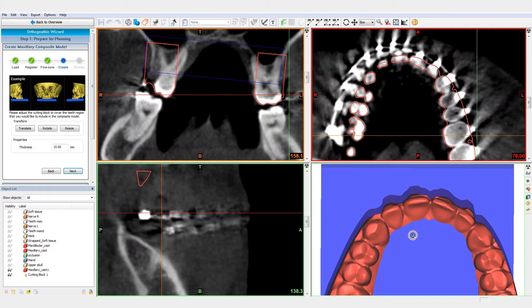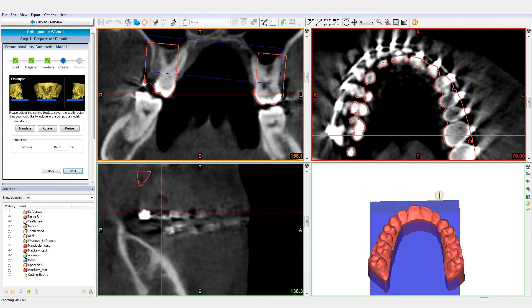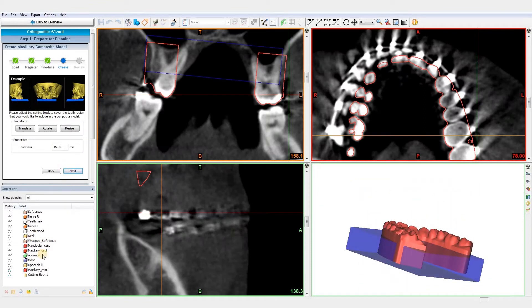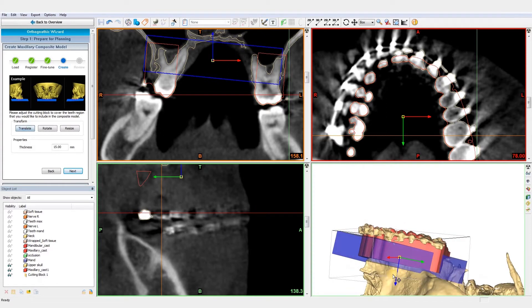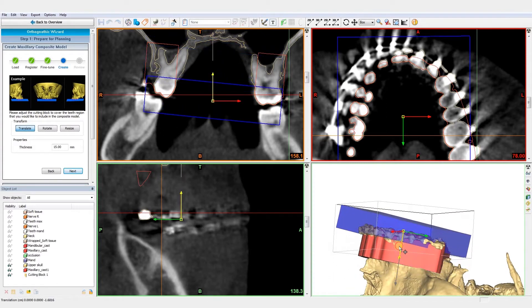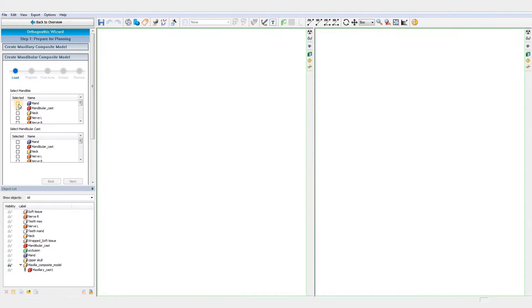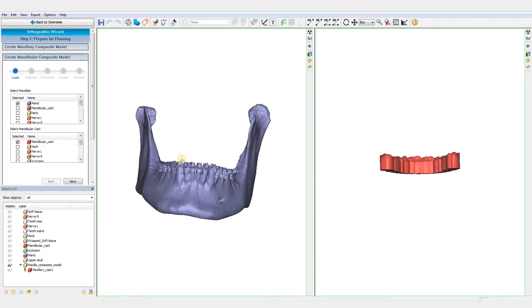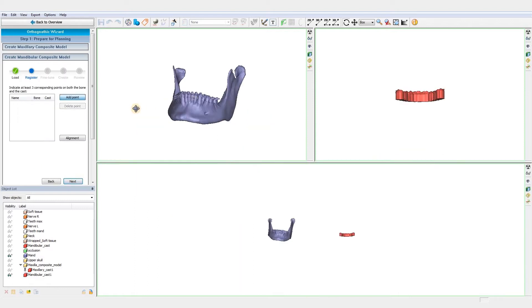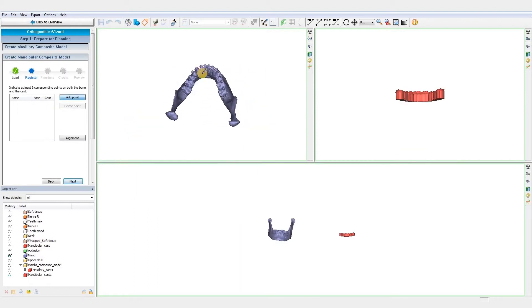Now, we will merge the dental cast with the CT model by aligning the blue box with the teeth. After clicking Next, the composite model is ready. To create the mandible composite model, we will perform exactly the same operations but now using the mandible CT model and the mandible cast.